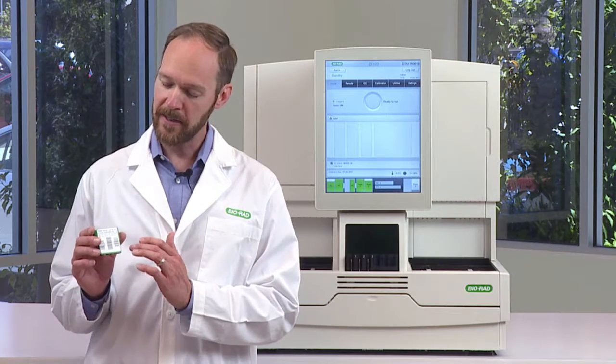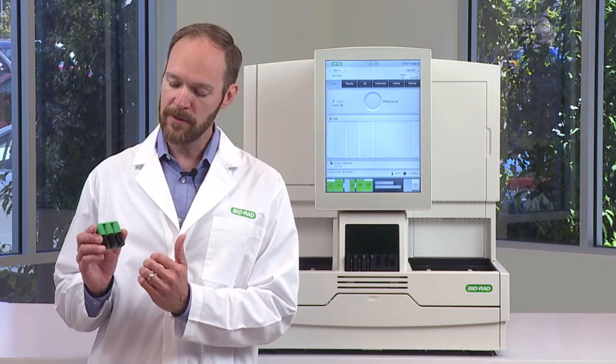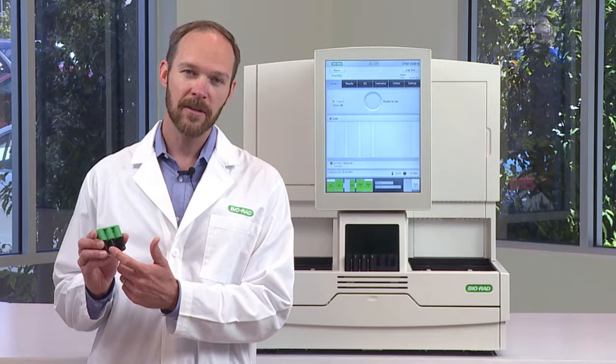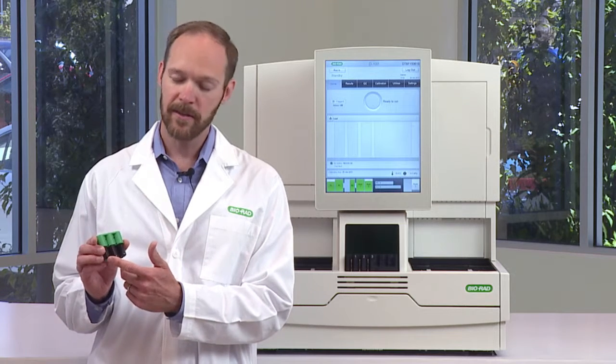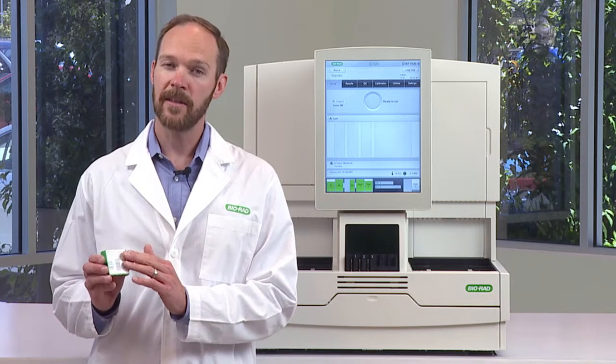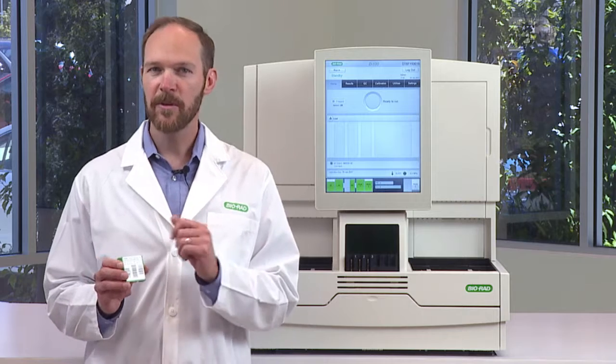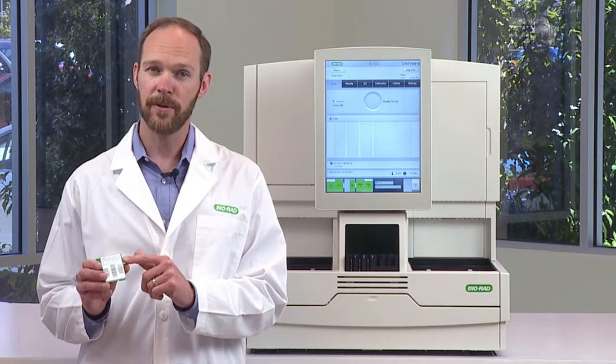The calibrator pack has a barcode on the front, and on the back you can see that it's actually three vials. The first is a conditioner, which prepares the cartridge for running, and the next two are calibrators level one and two. It comes lyophilized, but there's nothing for the operator to do here, because the D100 is going to reconstitute it for you.